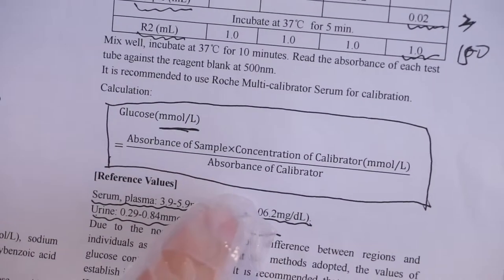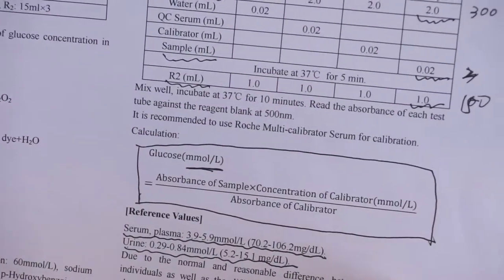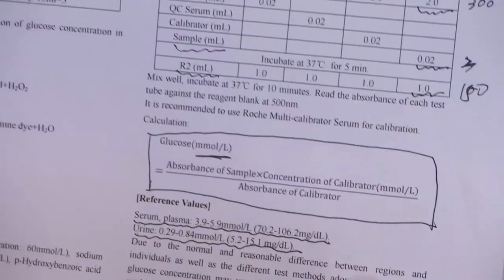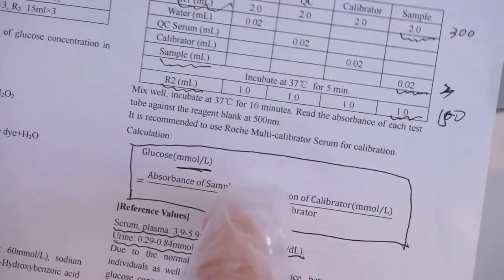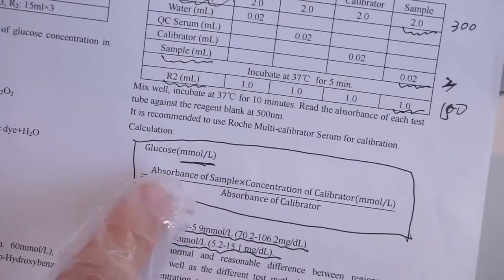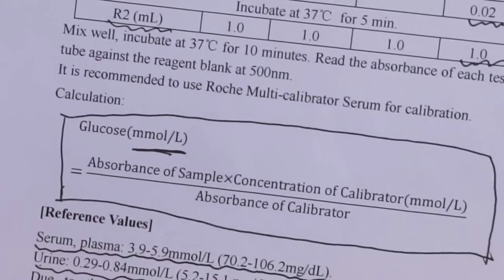Checking here, glucose, how to get the glucose concentration? You can see the concentration of calibrator. This one, we use the calibrator to do the calibration, right? So this is what we know. And also the absorbance of the calibrator. We will test it in the machine and we know this value, right? After doing the calibration, we will know this factor. And then we test the sample absorbance, and we get the absorbance and multiply by the factor, and we get the concentration of glucose. So from here, we use the endpoint for the test.